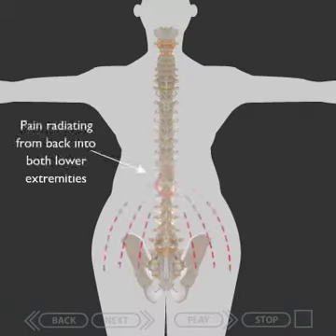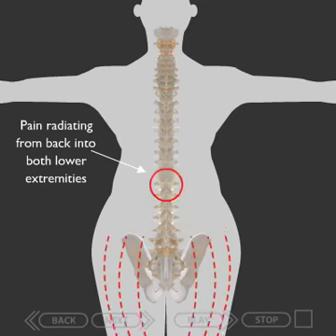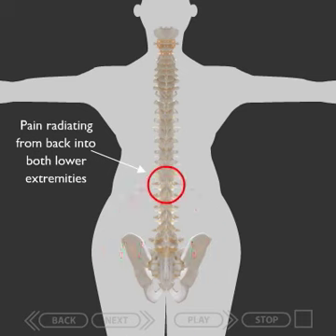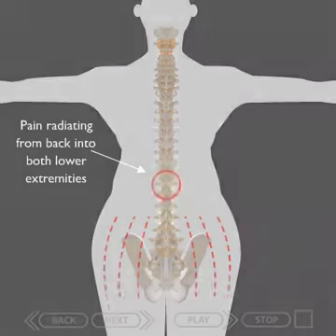Epidural steroid injections using the traditional translaminar or midline approach is frequently used when patients present with symptoms of pain radiating from their back into both lower extremities and have not had prior back surgery. Surgery often leads to scar tissue formation, which in turn can prevent the spread of the steroid solution onto the irritated nerve or nerves. This approach does not require fluoroscopic guidance and is also the approach typically used for laboring women to reduce the pain of childbirth.